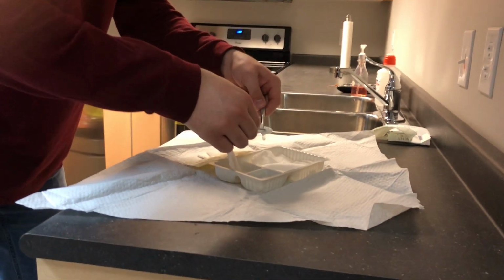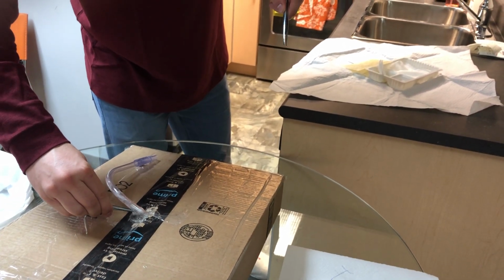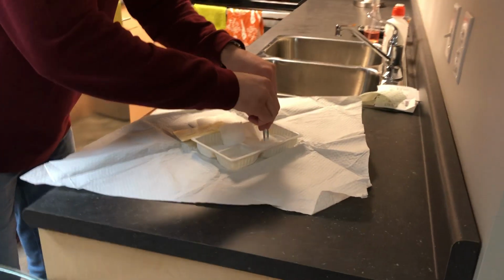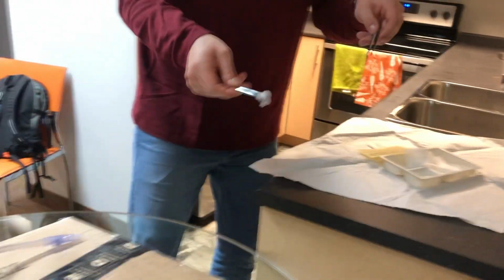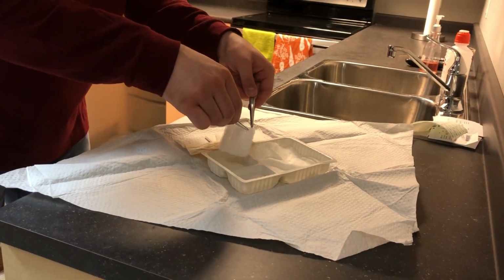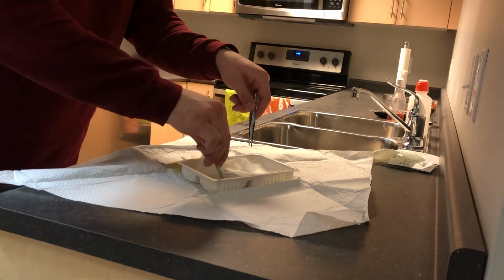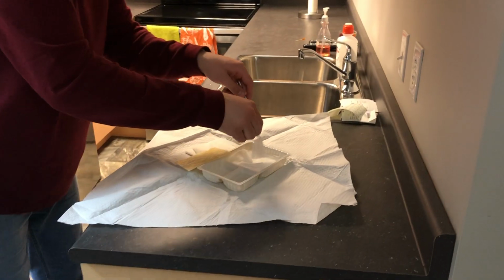Dab it in some normal saline, get rid of that excess fluid. Start from the innermost portion, being careful not to touch the forceps to the skin or the tube. Create very nice rosettes here. Good. Start a little bit more outer now. Good. Make sure you get all the way around. Probably just need one more swipe around there. Good. Now we can cleanse the tubing itself.